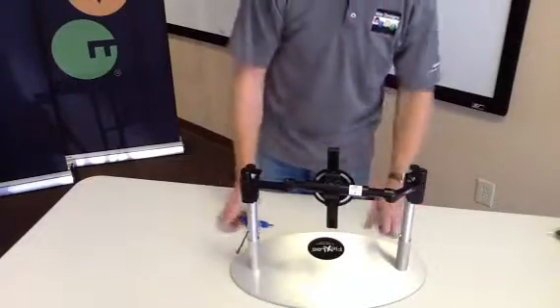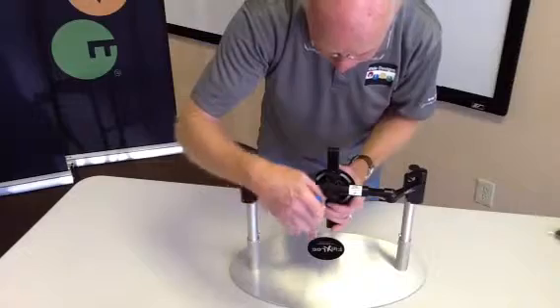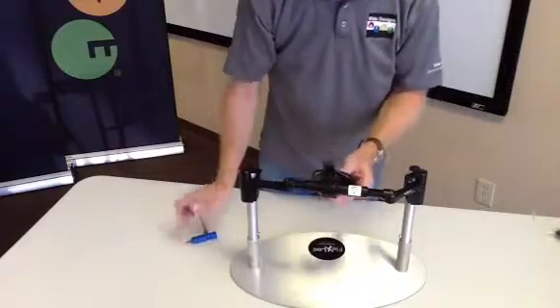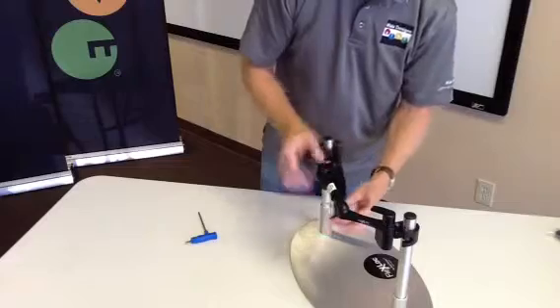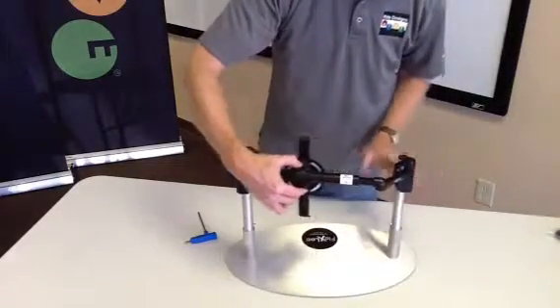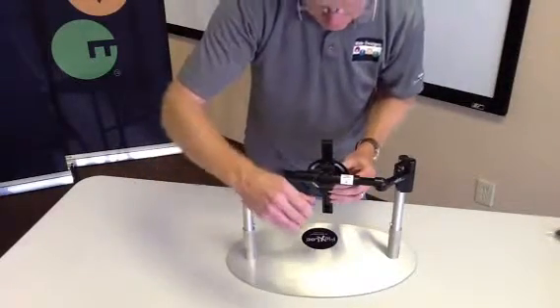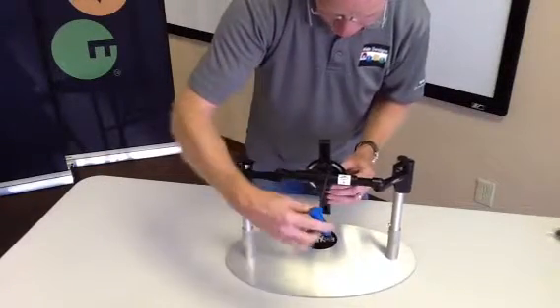Next you may want to fine-tune your back angle. The center clamp, when loosened, allows us to work with our seat-to-back angle, and also fine-tune the lateral position of the back support. I'm going to fine-tune my back angle and tighten those down.